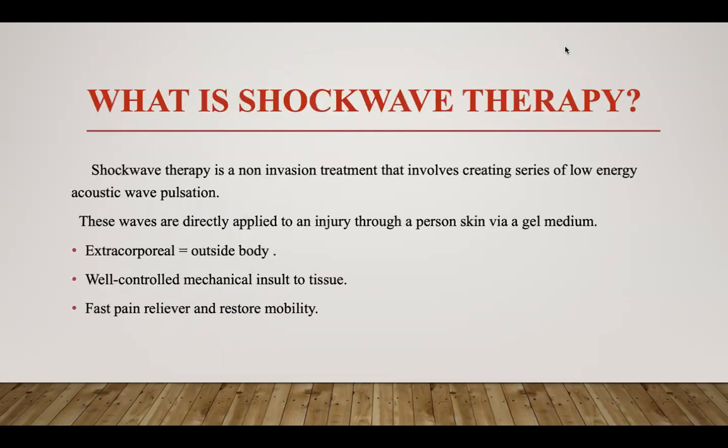What is shockwave therapy? Shockwave therapy is a non-invasive treatment that involves creating a series of low-energy acoustic wave pulsations. These waves are directly applied to an injury through a person's skin via a gel medium. Extracorporeal is outside the body, that is how the shockwave is used. Well-controlled mechanical stimulus is delivered to tissue for fast pain relief and restored mobility. Now, let's move to the history.